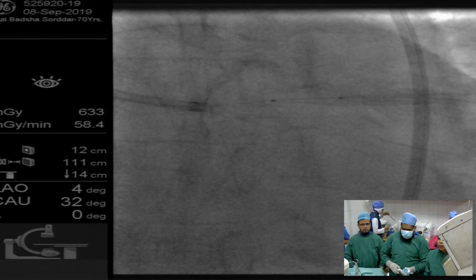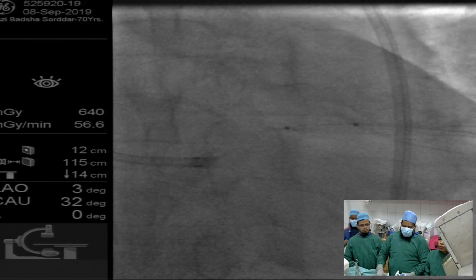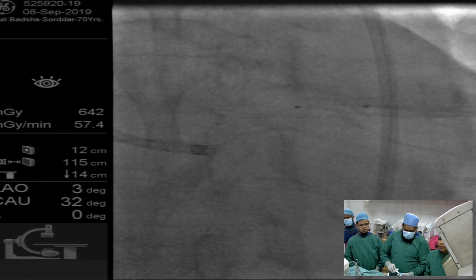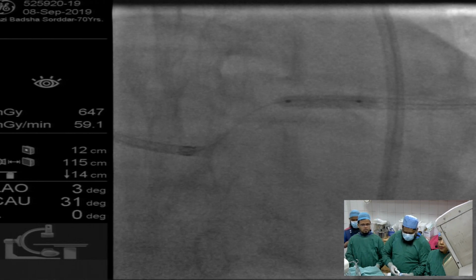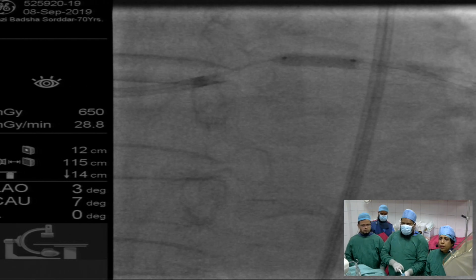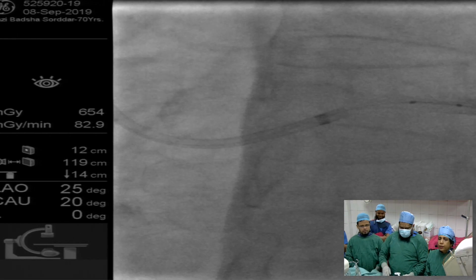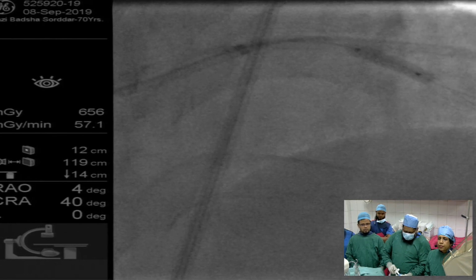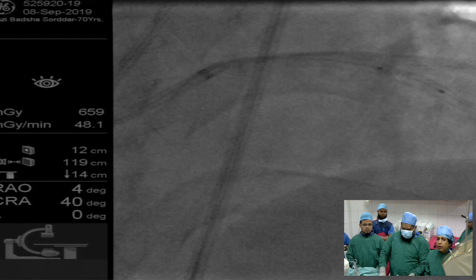This balloon's a bit bulky, you see. It's been already used quite a few times. And the stent is also not fully deployed. Yeah, we can dilate here because we're inside the structure. 8, 10, 12, 14, 16, 18, 20. Okay. It's really bulky. Okay, so we'll go down maybe. 10, 12, 14. And the last bit is not obviously we can.